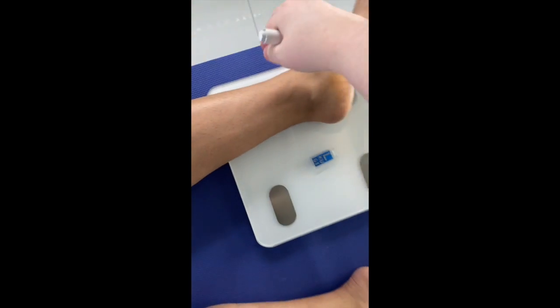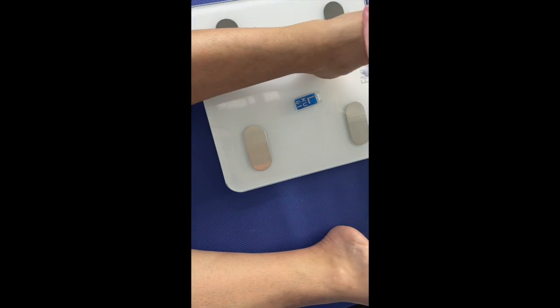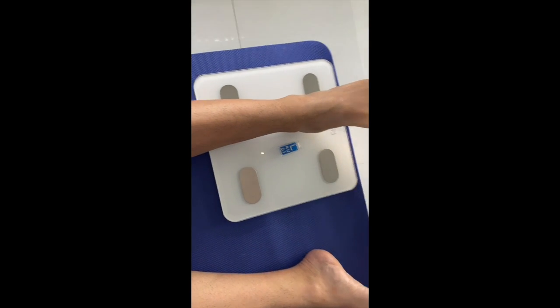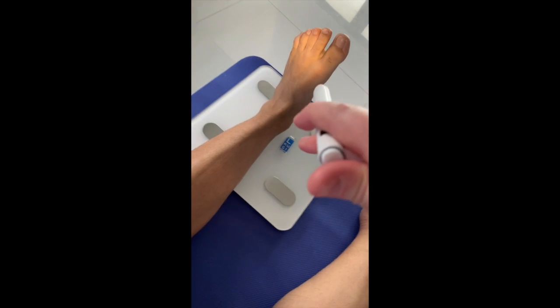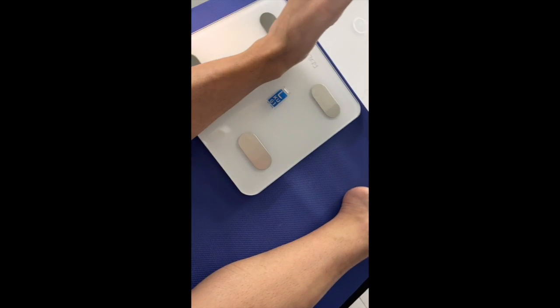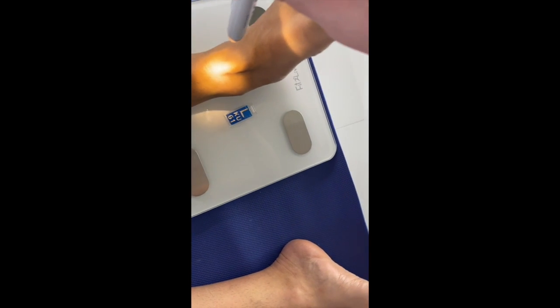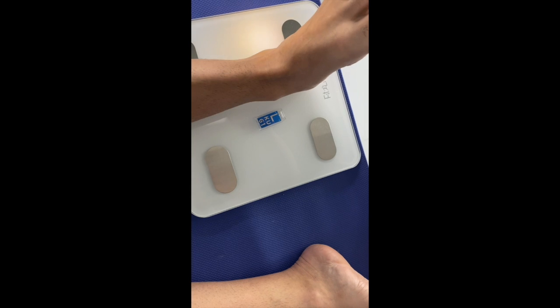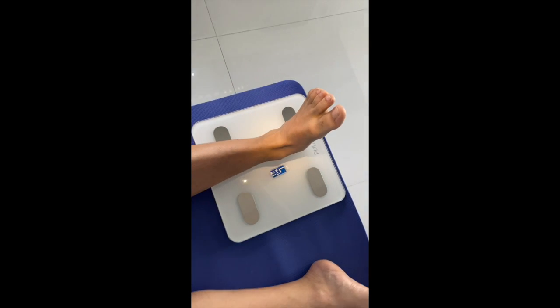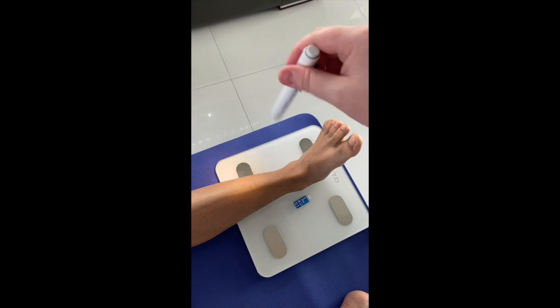So for the AP ankle, our patient is going to be either supine or seated on the table with their leg extended. You want to make sure that they're in a true AP position and make sure that their foot is flexed up. Our central ray is going to be perpendicular to midway between the malleoli. We're going to be using an SID of 40 inches and a 10 by 12 cassette.